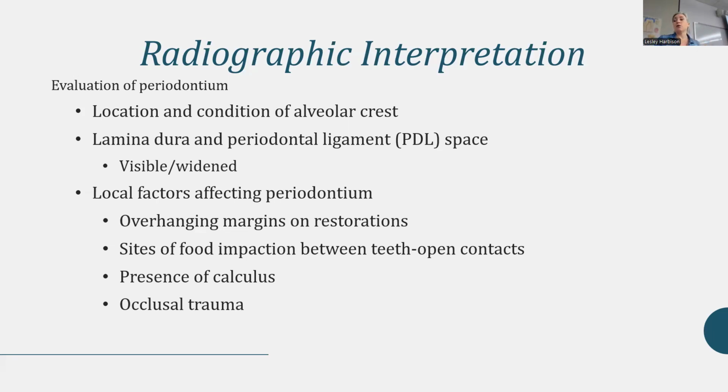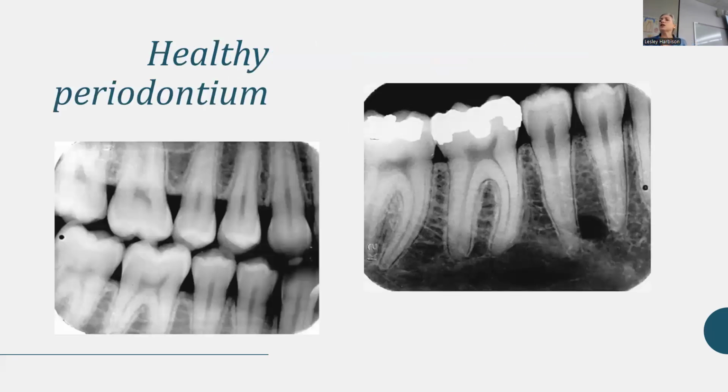and maybe there's other factors like GERD or acid erosion? So here's a couple more pictures of healthy periodontium. And sometimes we lose some density too, so that here, this image has lost density. So somebody might say that looks like bone loss, but it's just the way the picture was clipped and it was put on the computer.